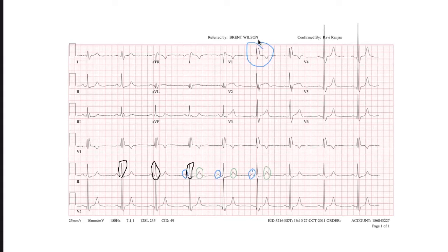So that should tell you, okay, if the wave is going towards an electrode, just remember, because Lindsay said these are all referenced to Wilson Central Terminal, the measurement direction is from the center of the heart to the electrode, so that's the arrow. If you project your major heart dipole onto that, it means it's going in that direction, it's positive, right? And so that means that it must be going to the right side slower at the end.